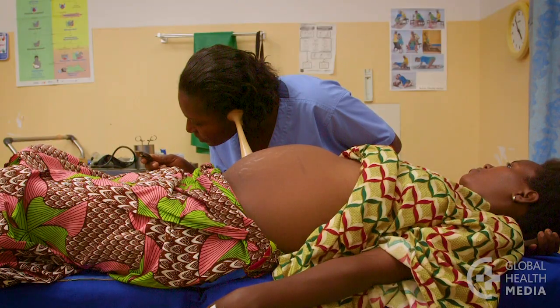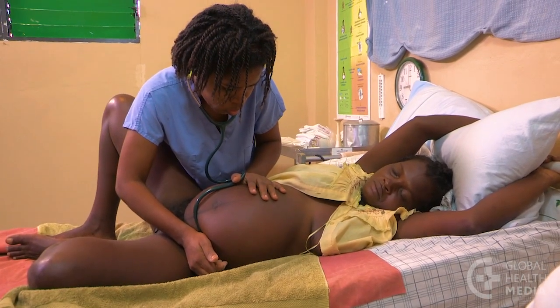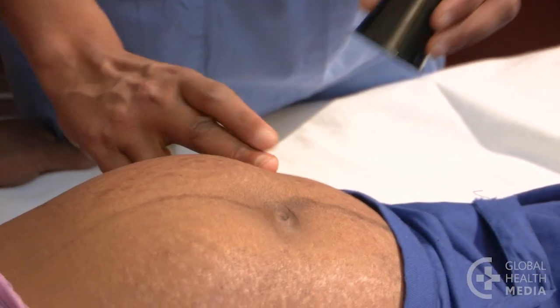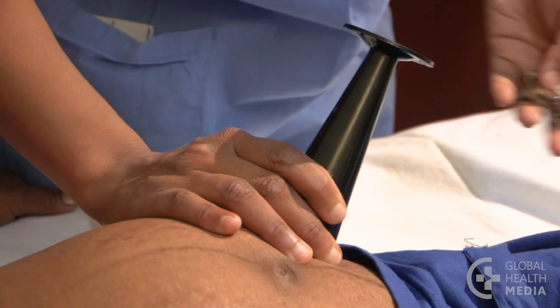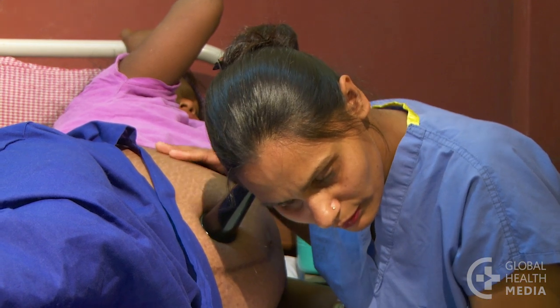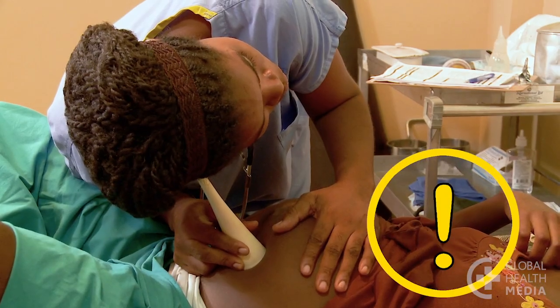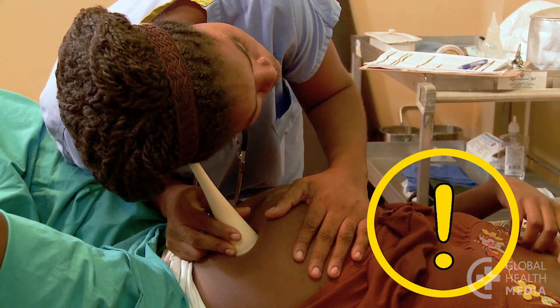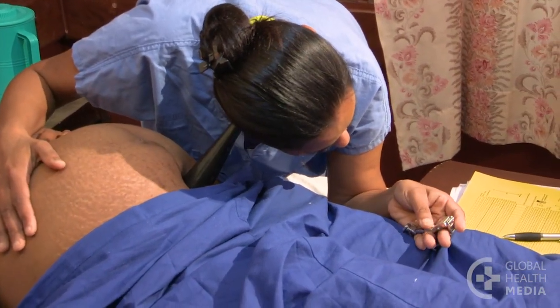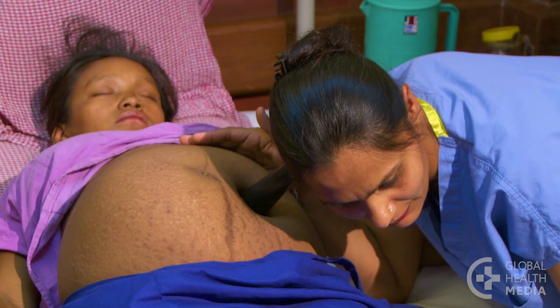You can listen with a fetoscope, a stethoscope, or a Doppler. To use a fetoscope, press it firmly over the spot you think the baby's heart should be. Put your ear to the listening part, then press your head down on the fetoscope firmly and take your hands away. This is important — keeping your hands on the fetoscope won't let the sound come through clearly. You may need to listen in several places before you find where the heartbeat is most loud and clear. Take your time; sometimes it takes a few seconds before you can hear it.